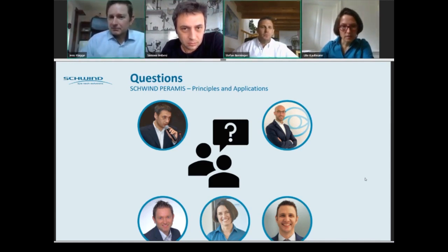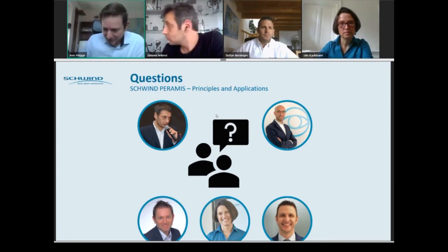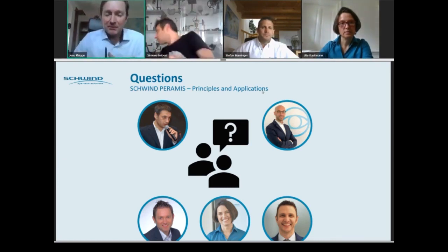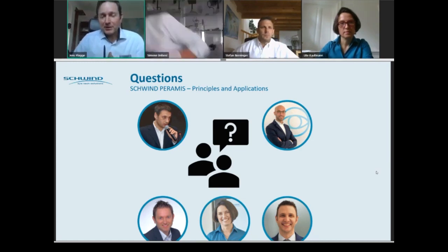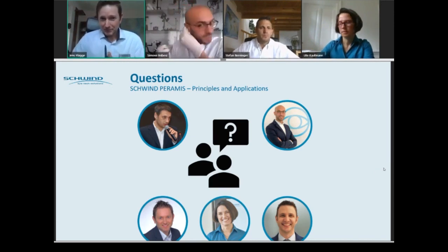I think this was all for the moment. Then I have actually a question that might be interesting for the audience. As Simone showed the refractive maps and how you can compare them, so differentiate them, the pre and post-op maps, could you determine the optical zone from there, from those difference maps?